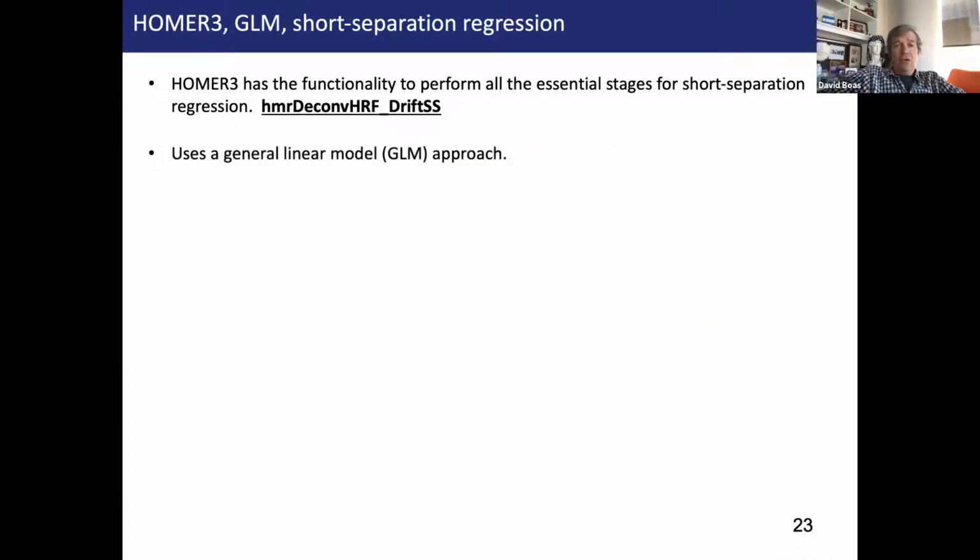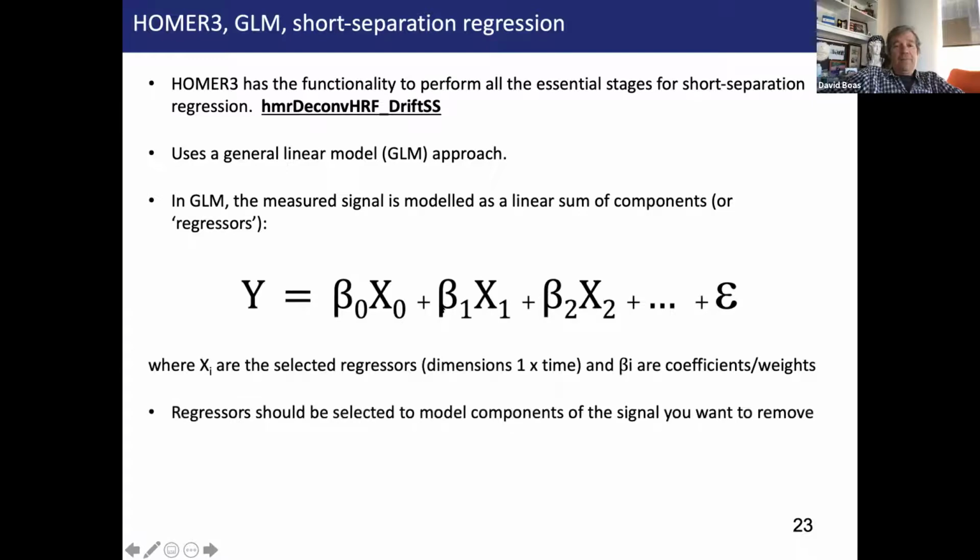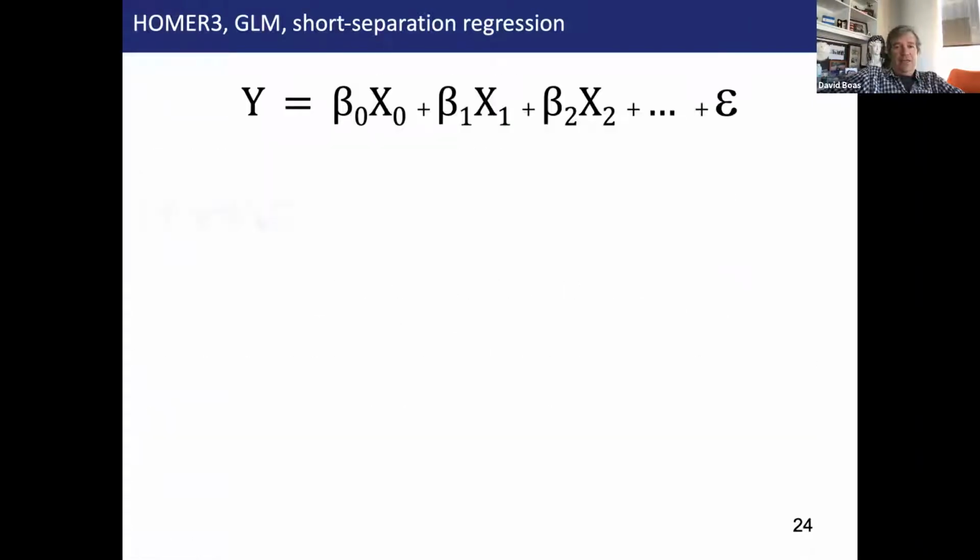Okay, so in Homer, we use a GLM. Actually, we renamed this. You should go back and change the slides. It's the Homer run_GLM function. We'll see that when we open up Homer. And so we model the signal with many different components, and I'll show that here.